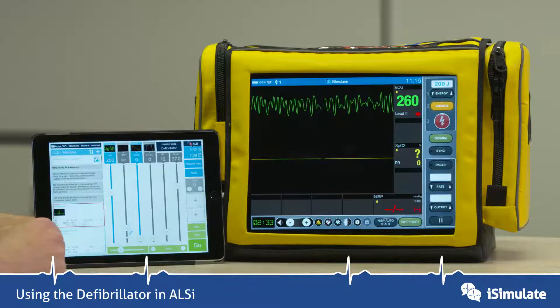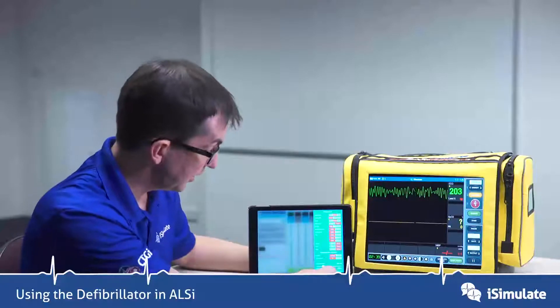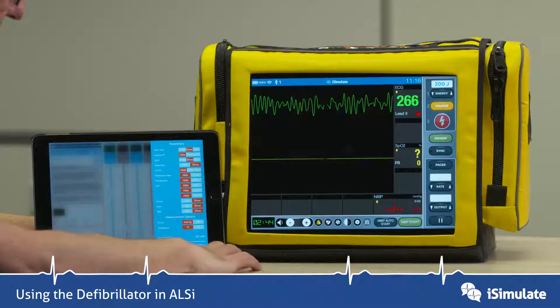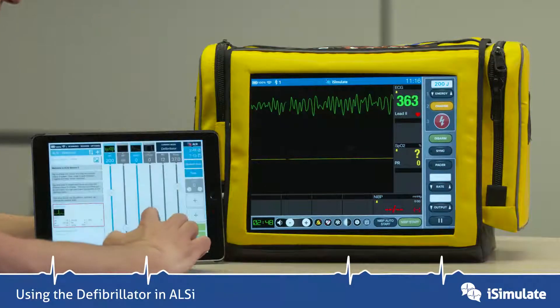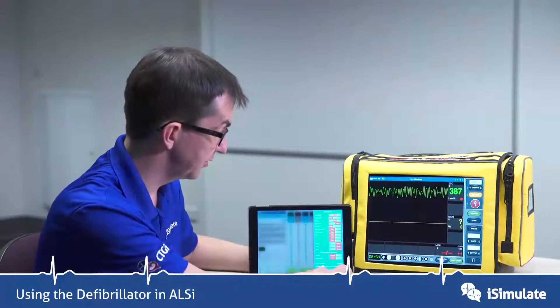You can alter a number of things on the facilitator's pad as well. If you tap on options, you can alter the shock default — that's the shock number that appears when you go onto the screen — so you can reduce that down or move it up according to your local service. I'm going to put it back up to 200 joules.